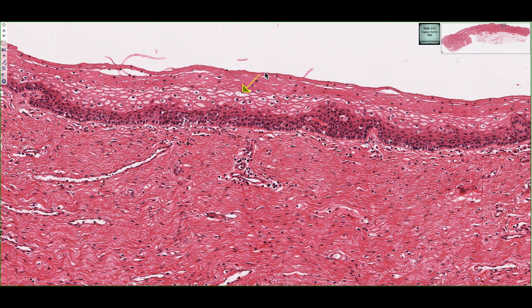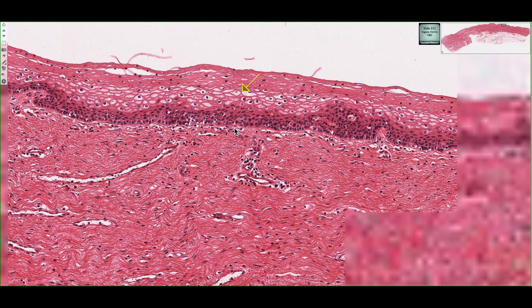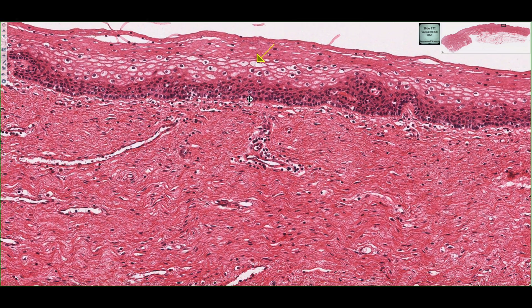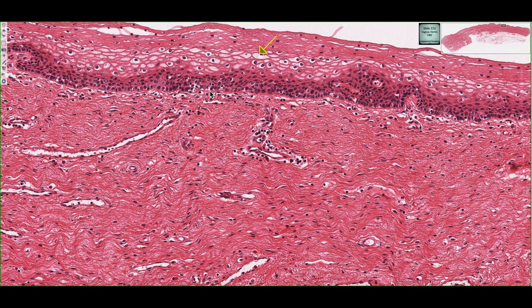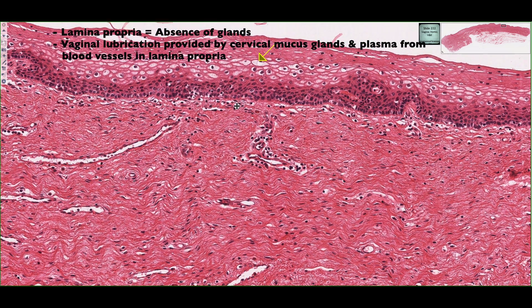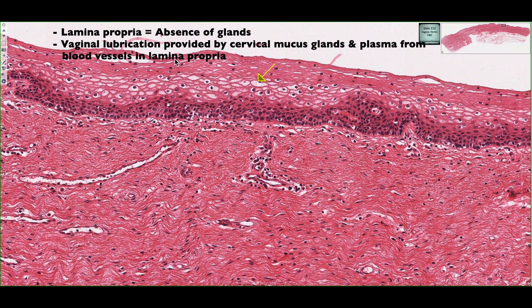So it's a protective mechanism. And if we note in the lamina propria, just deep to this epithelial lining, we can see an absence of glands. The vagina is actually lubricated by the mucous secretions from the cervix and the glands that are found there.